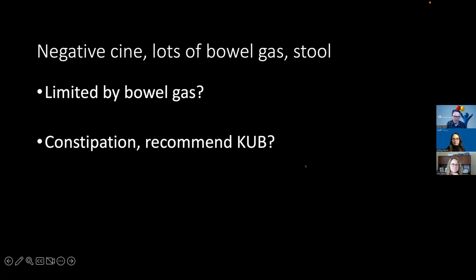Yeah, no, I agree. And I'm from the younger generation, so we don't get as much focus on plain film, but I've been told the same thing. If you have a radiograph that shows really nice bowel gas all throughout the cecum and ascending colon, then that's pretty effective at excluding intussusception. You know, the sonographic equivalent to that.